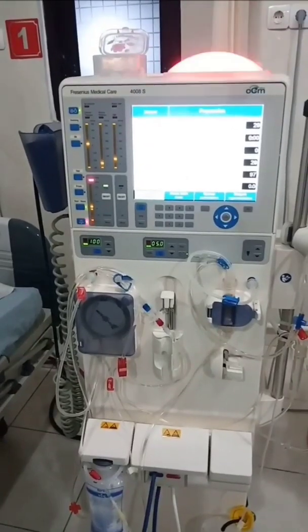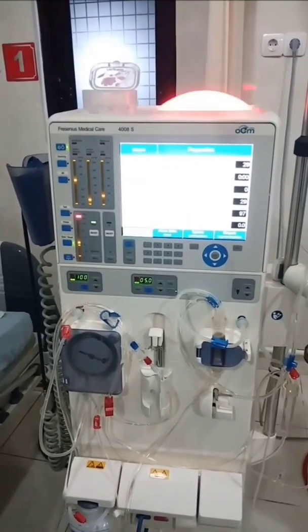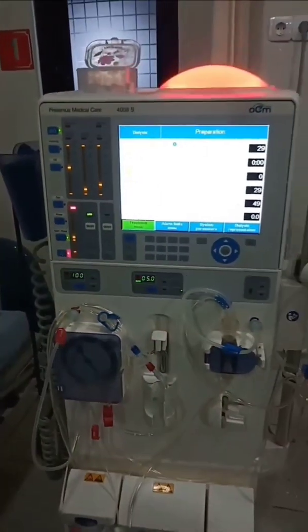Unplug the arterial AV fistula, press the puncture site. Run blood to the end of the fistula. Stop Qb and release the AV fistula.